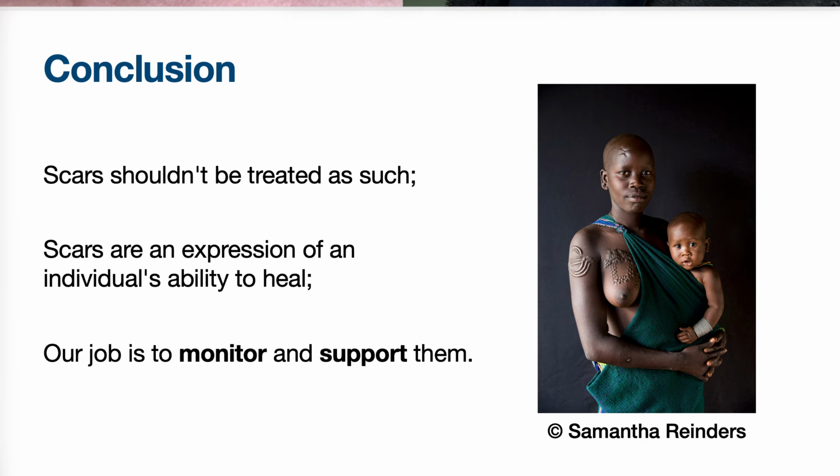To conclude, a multimodal ultrasound approach combining HF US, SWE, and SMI represents a non-invasive, objective, and quantitative tool for assessing keloid severity and monitoring therapeutic response. This method can improve patient stratification, allow early identification of non-responders, and support a more personalized clinical management.